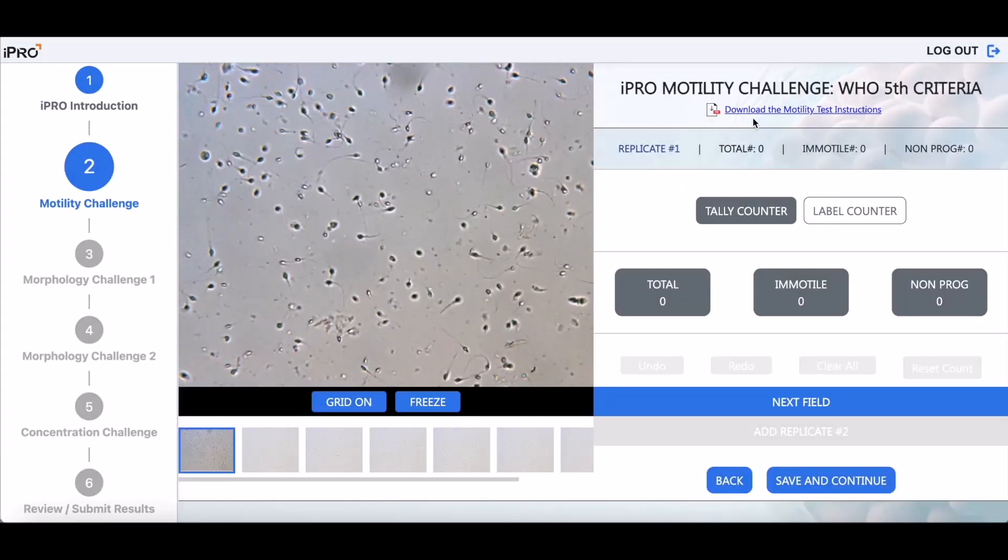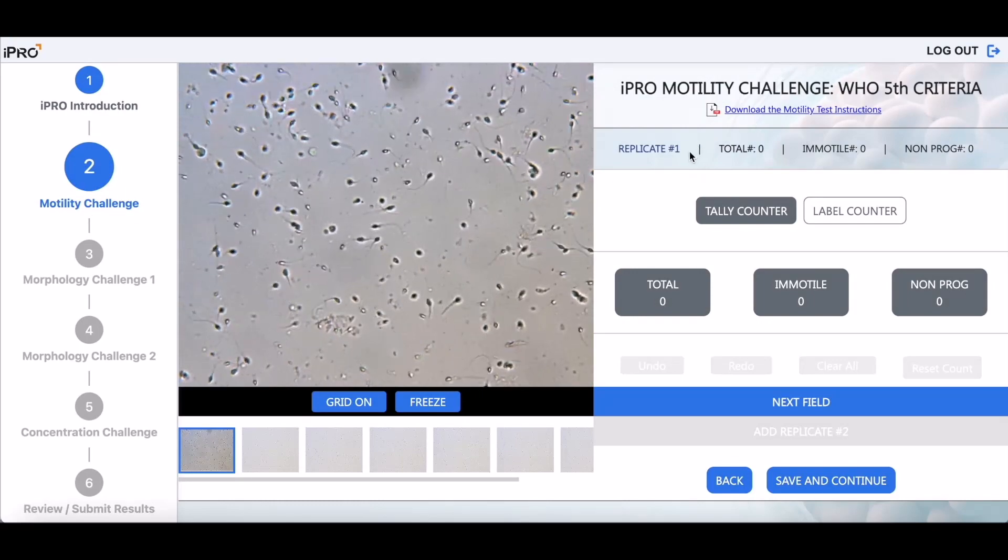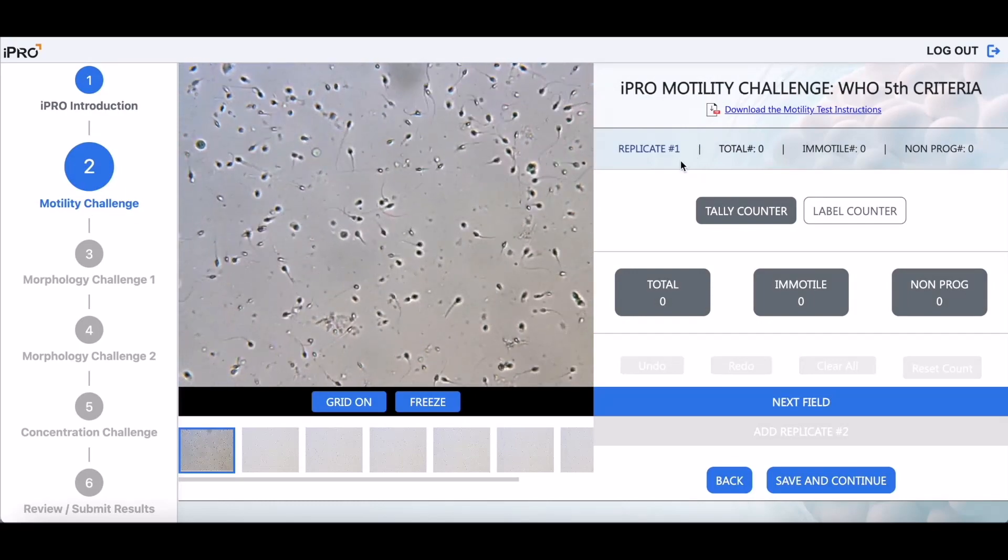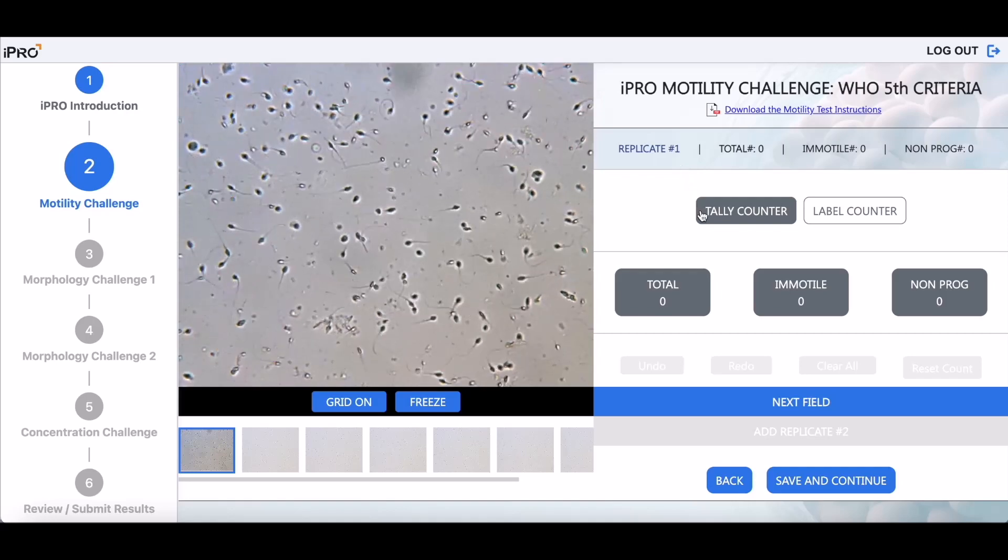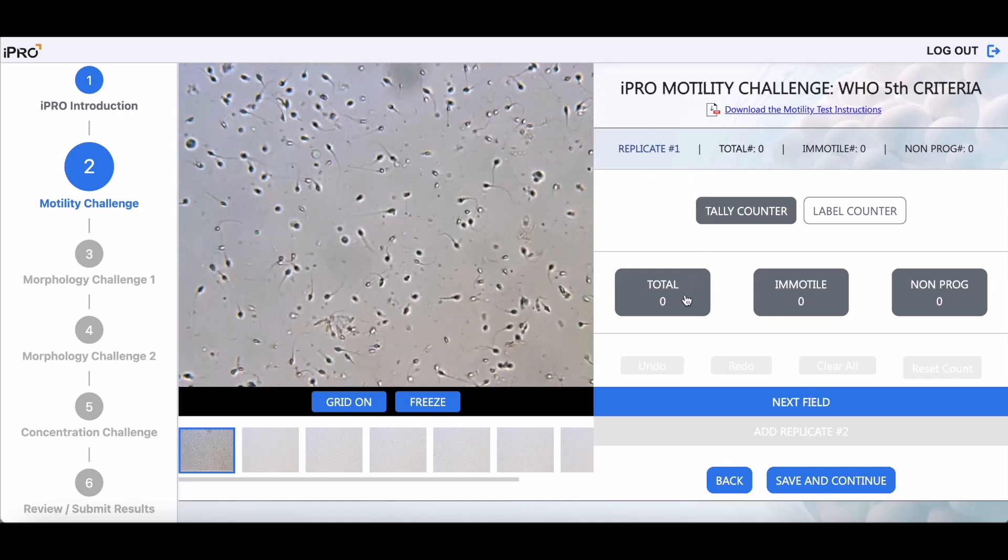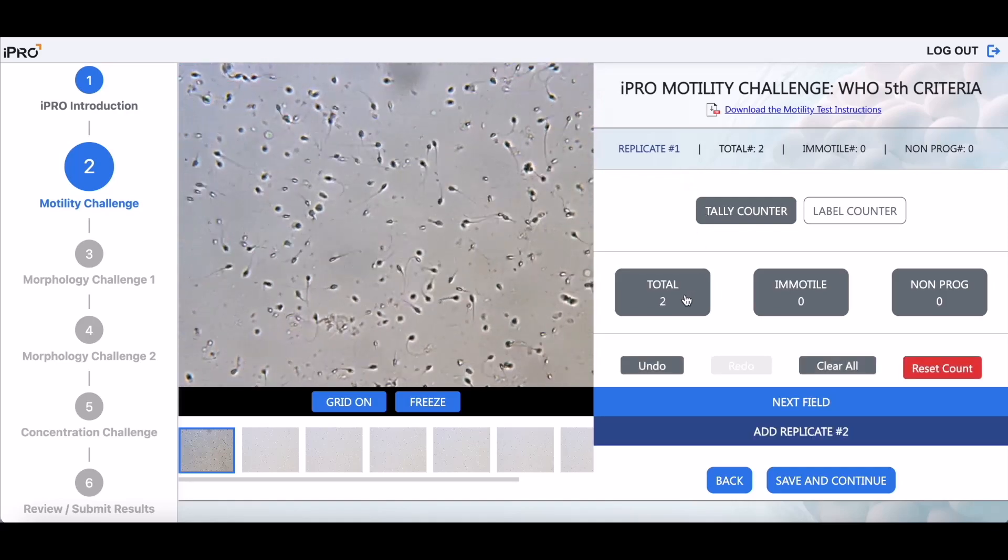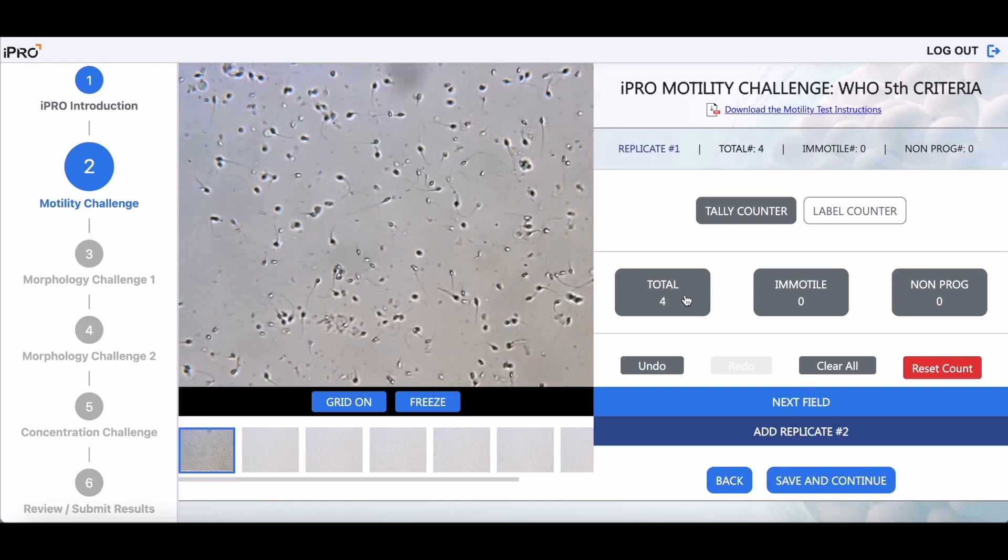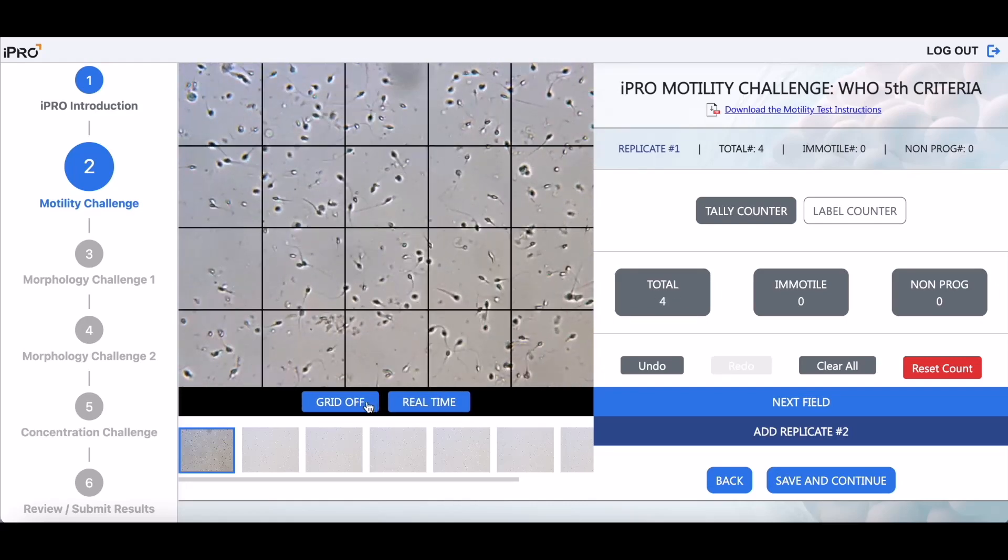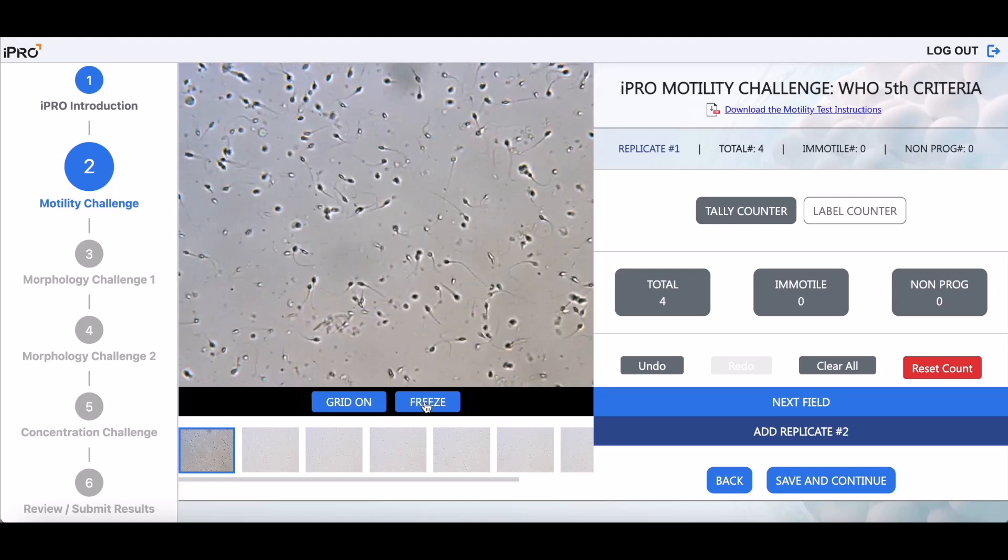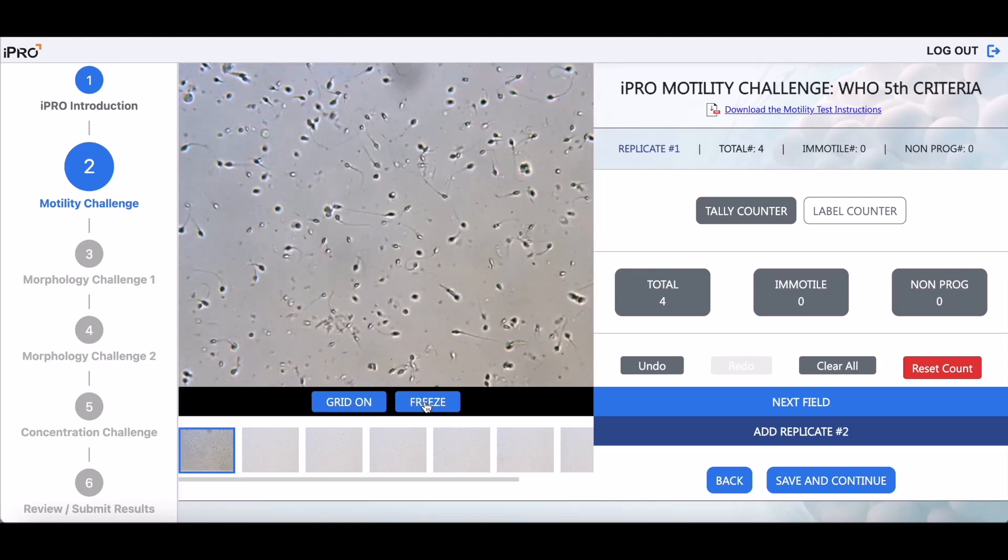See the various cell counts being updated while you are completing the motility challenge. Use the iPRO tally counter. Simply click on the appropriate box as you count each cell. Click Freeze, Grid On, Grid Off, and Real Time to make cell counting easier and more accurate.